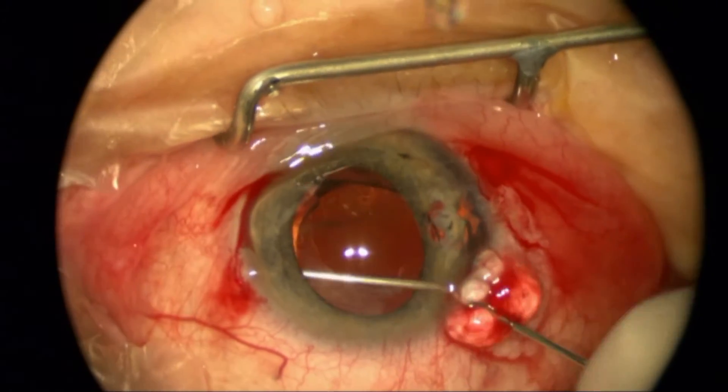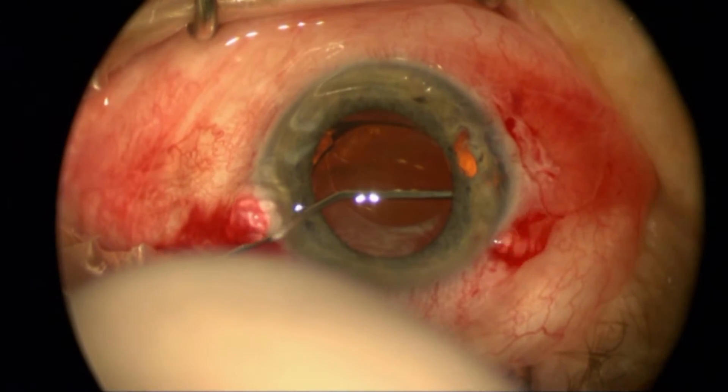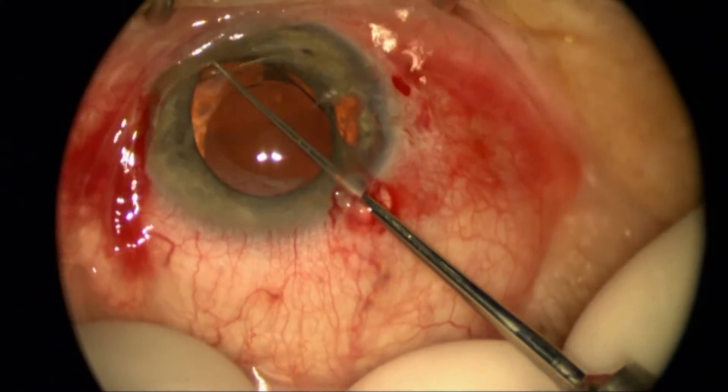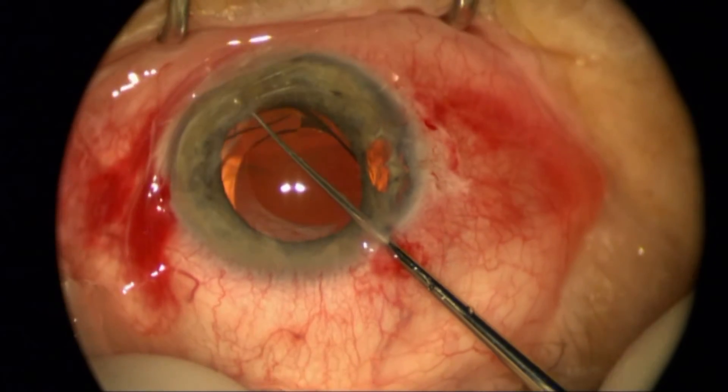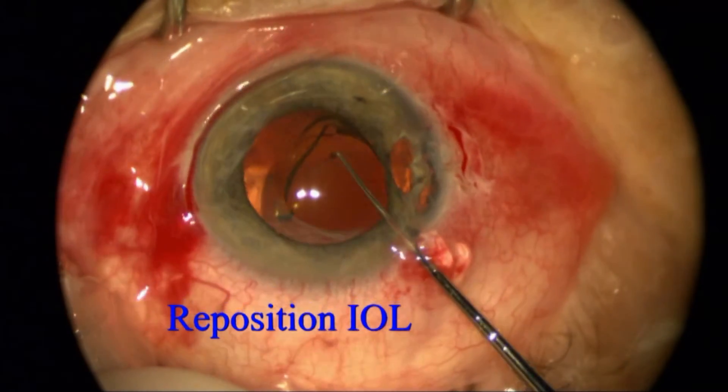I'm prepared to exchange the lens, but if I'm successfully able to open the bag completely and it's a good lens with the proper power — like it is here — I'm just going to go ahead and put this single piece lens within the capsular bag.